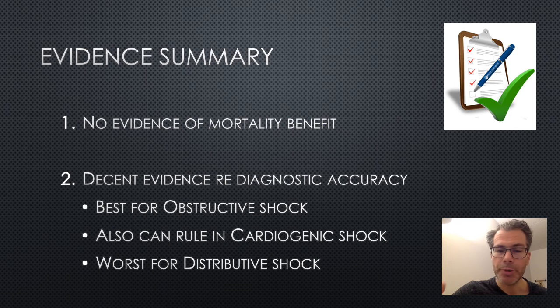If the patient already has a clear source of their shock, if they're febrile, have a clear source of sepsis, then you don't need to mess around with an ultrasound, just give them IV antibiotics, source control. But if it's really undifferentiated shock, you have no idea why they're hypotensive, just the 2 minutes that it takes to perform a HIMAP can sometimes give you an immediate diagnosis. So if it's used in an intelligent way, I think we should be performing a focused shock protocol on all our patients with undifferentiated shock.